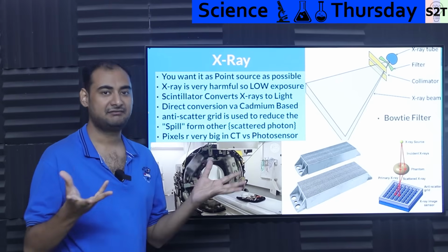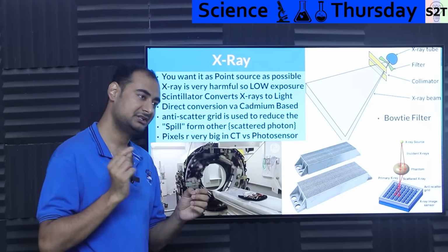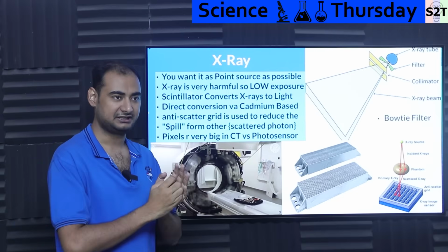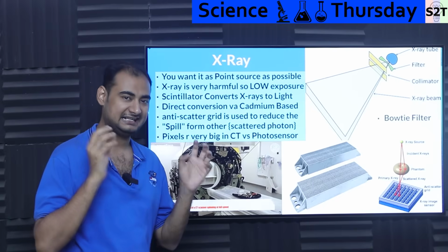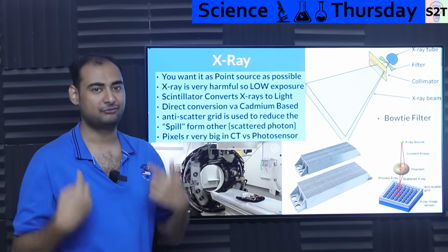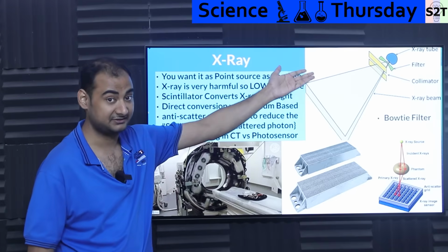Now, you have the X-ray source, super easy. You just take ludicrously high DC voltage, you put it in a chamber, and then you send electrons from one source, generally tungsten. You dump that puppy into an anode, and that anode is like yeet. The X-ray is emitted when the electron's energy is trying to slow down way too quickly, so it has to dump energy somewhere. Sometimes it dumps it via a photon, and that photon is so high energy it is in the X-ray band. So you get that X-ray generation there from the X-ray tube.